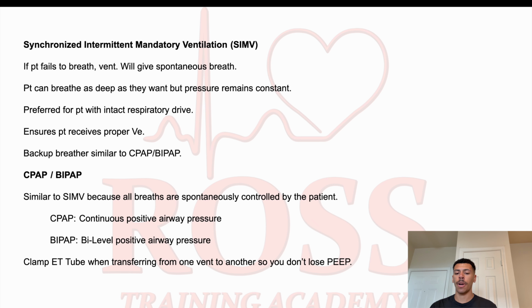And so this is going to be preferred for patients with an intact respiratory drive. And it's going to ensure that the patient receives the proper minute volume because you have your presets in there. So if the patient's respiratory drive doesn't kick in, the ventilator, which you have preset, will take over and deliver those breaths at the amount and volume that you already set. This is going to be similar more so to BiPAP. And on most ventilators, you have to go into SIMV mode first, and then there's a button or two that you click to get into the BiPAP mode.